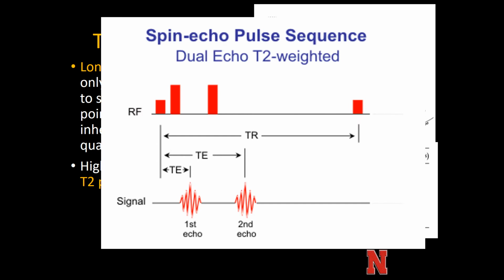If you look at a spin echo pulse sequence and there's a 90 and a 180, you're obviously thinking of a T2 weighted image. And if you see a longer echo time here, then you're going to be guessing a T2 weighted image. The diagram they showed, I'll be fair, you're thinking to yourself, this looks exactly like a T1 weighted image, right? Because you can't really make out on these various timelines when exactly this echo time is, unless they give you some idea. And I'll tell you, here's the way that I always cheated it.